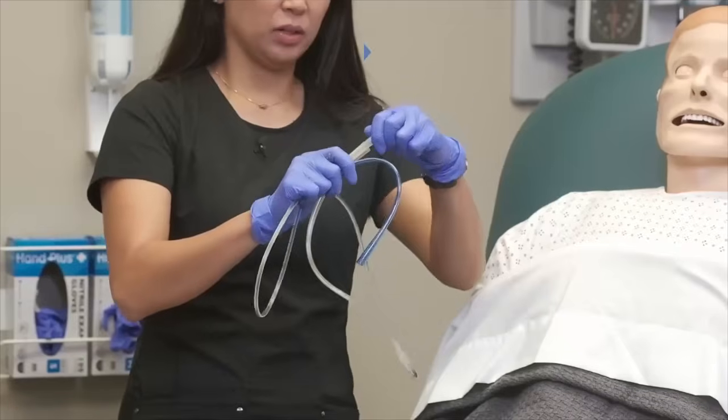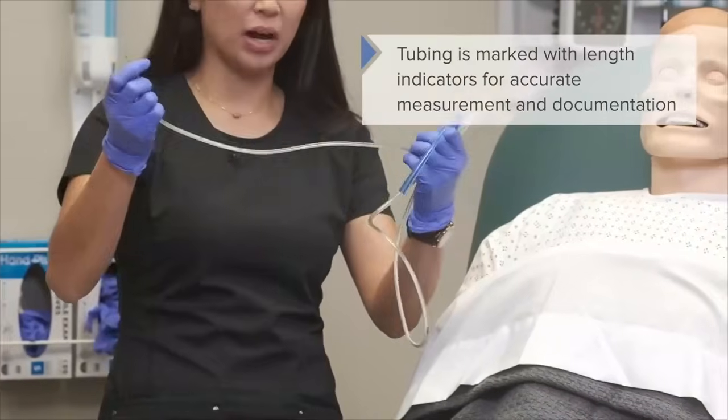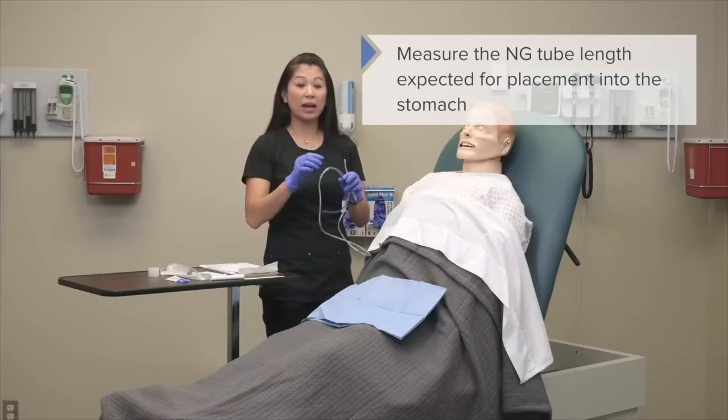Okay, and remember, I've got clean gloves. This is open, this is not a sterile procedure. So I've got my nasogastric tube here. Okay, so now we've taken a look at our tubing. Let me show you how to measure.